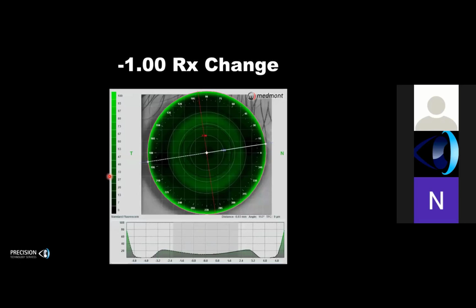And this is an important understanding relative to the story of building better orthokeratology lenses. Here's a treatment to create a 1 diopter effect. And I want you to concentrate your attention on the graph down below. Notice how little tear layer profile difference you need between the center and the reservoir depth to create that tiny little 1 diopter effect. It's a very subtle difference in the thickness of the fluid in the center versus the thickness of the fluid at the reservoir, deepest point of the reservoir.